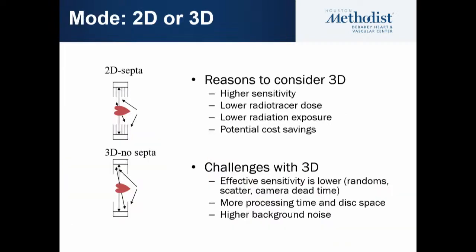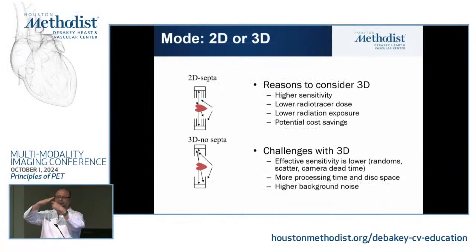The other aspect that you need to know about is that in the past, we used to be able to align exactly where that photon came from. There are 2D systems, where we put septae in front of the detector, so we get only the ones that are coming and hitting the detector on a straight line. If something is coming scattered like this, or any other way, then we will not detect it. Now, with the advent of new electronics, we are able to correct for that, and we know how much is scatter and how much is through.